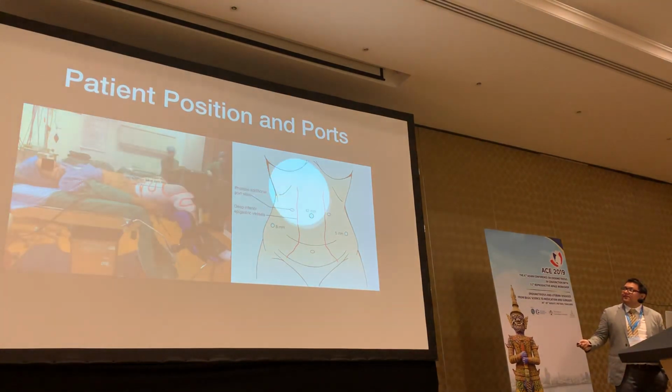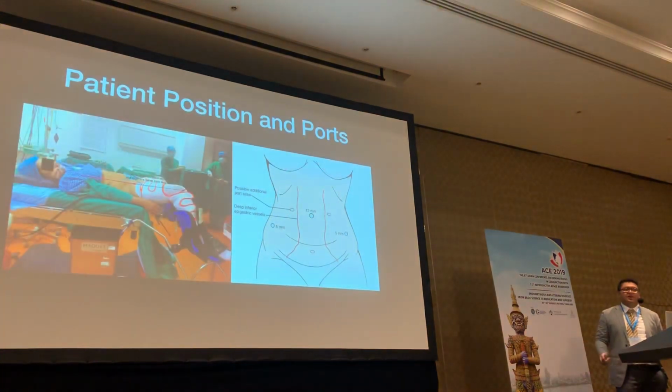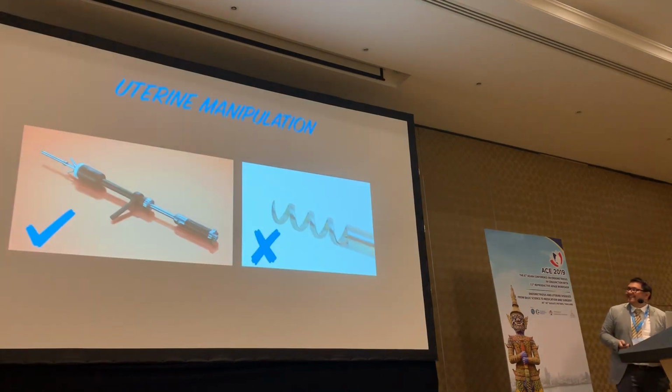Port placement, I use an optical entry through the umbilicus, the Lee-Wang point for larger uterus or scarred abdomen. For TLH, I like to use an ipsilateral port placement because it makes my suturing easier. I will use a midline infra-umbilical port for DIE to dissect deeper down into the pelvis. For my right hand, I like to come a little more medial. Dr. Prashant and I have different viewpoints on that, but that makes interesting OR discussions.